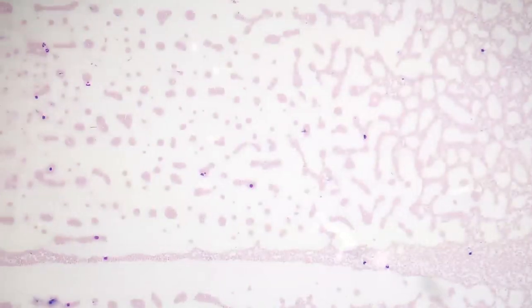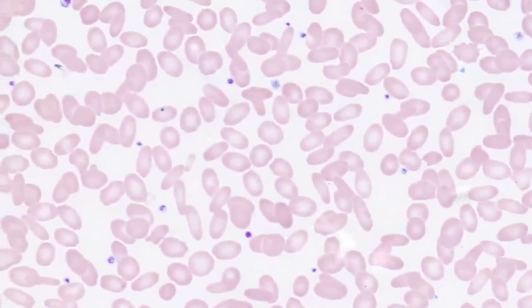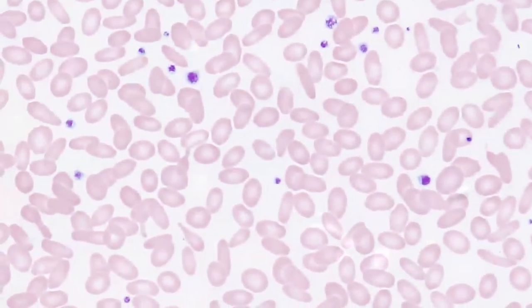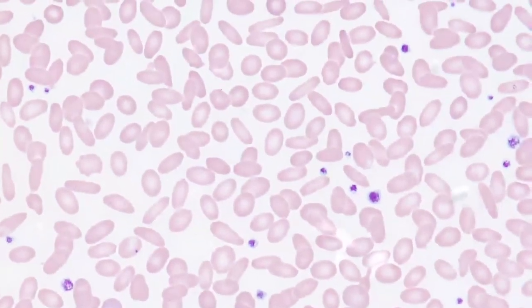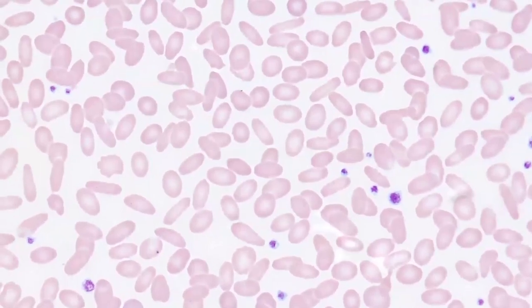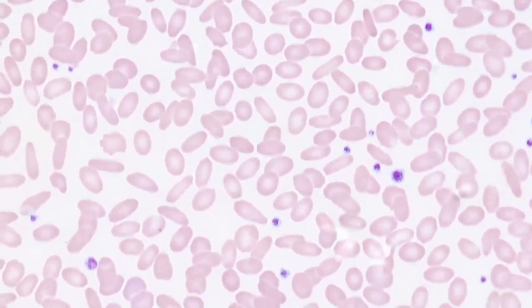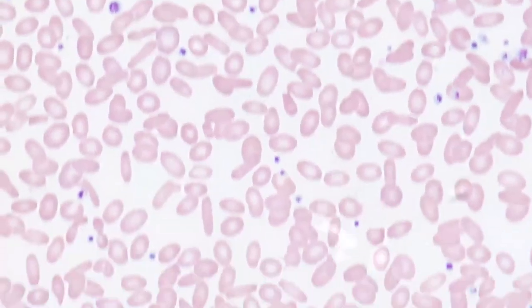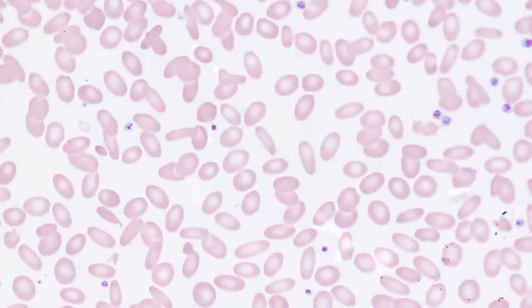Another example of a red cell membrane disorder is hereditary elliptocytosis. So here's an example of hereditary elliptocytosis. At high power, we can see that nearly all the red cells show some sort of elliptocyte shape. This is not to be confused with the elliptocytes seen in iron deficiency anemia. Although similar, the number of elliptocytes in hereditary elliptocytosis is markedly increased in comparison to those seen in iron deficiency anemia. Again, a defective spectrin is the most common abnormality in hereditary elliptocytosis.